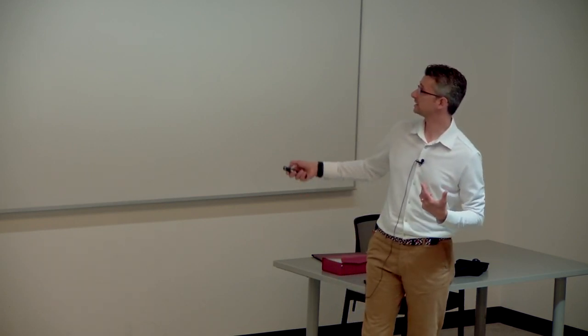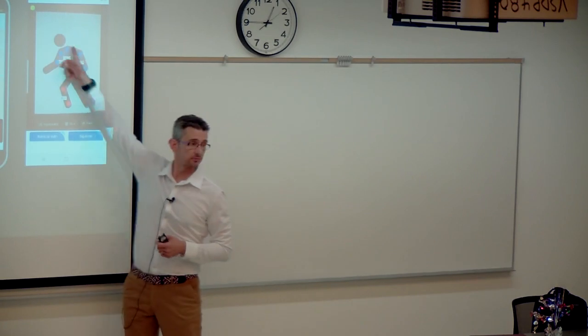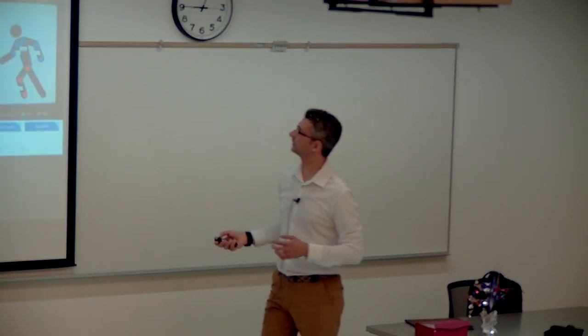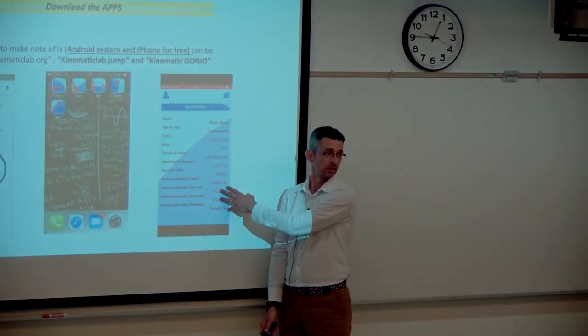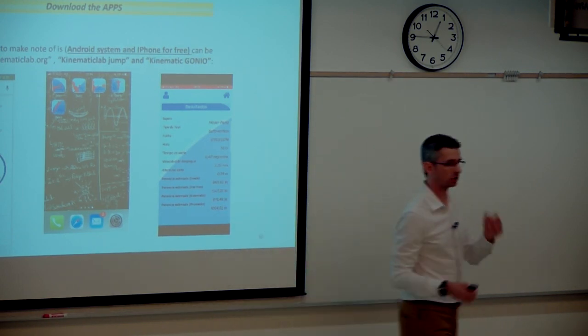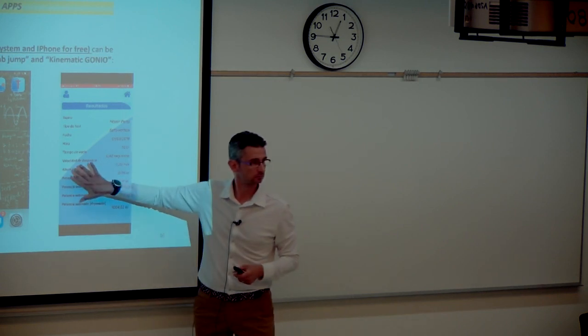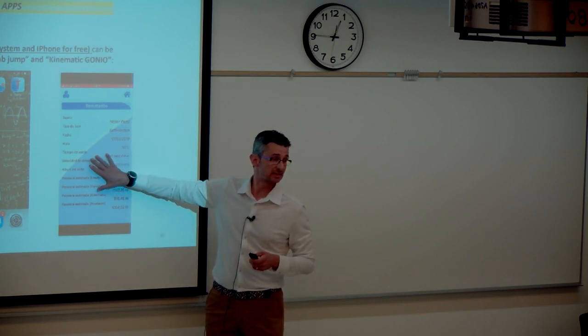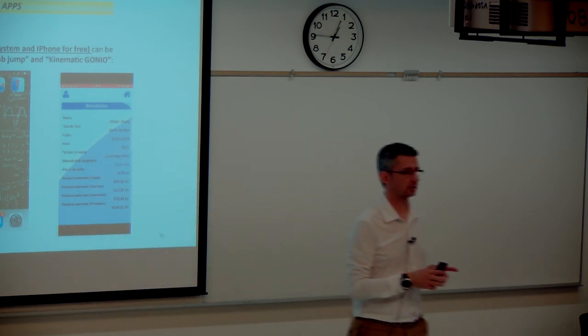With this one, it's not possible because the app is the same. If you want to record this, you have to take a picture and send it by email. With the other, with the kinematic jump, you have all the data inside the telephone, but you cannot send it and you cannot connect between them. To get this app, you have to log in, because it's very important that your phone has control over the people that enter the phone to take data from the patients.